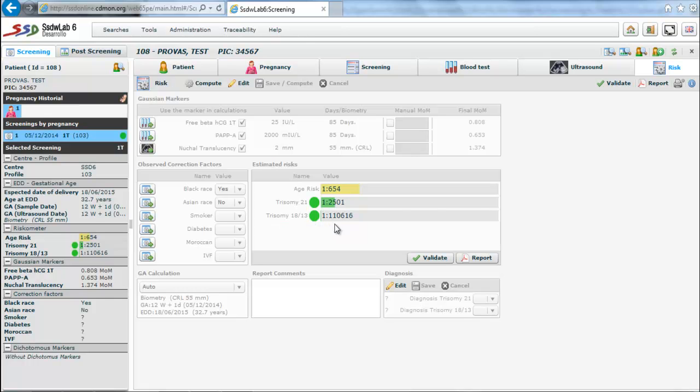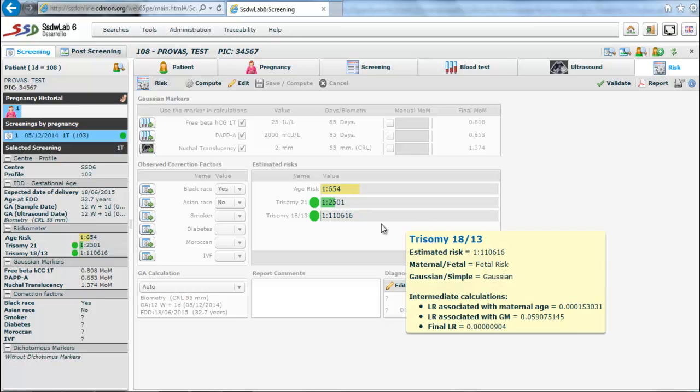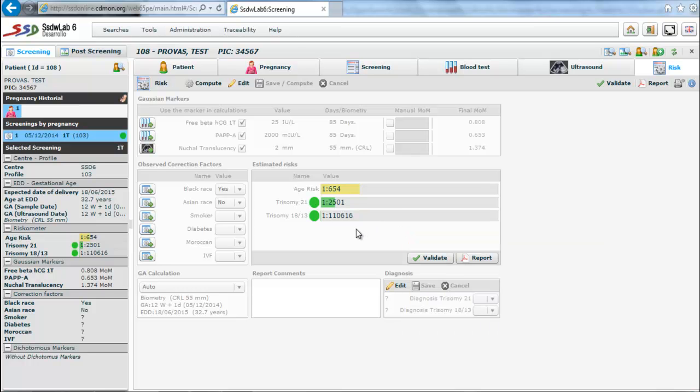These are represented by colored bars: green when the risk is low, red when the risk is high, and the risk of maternal age is always displayed in yellow.